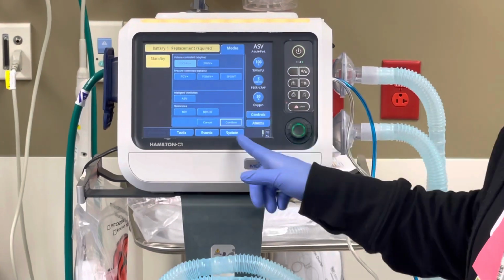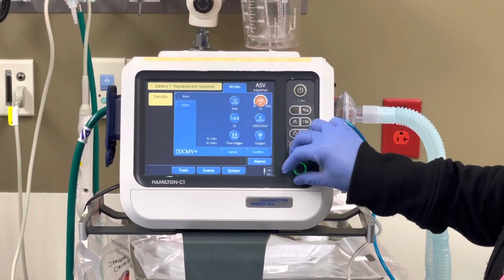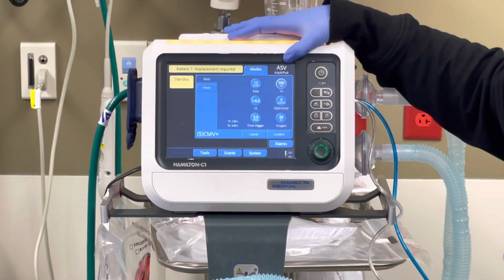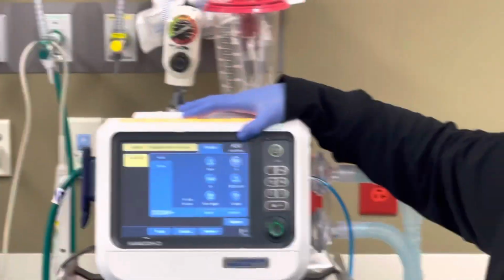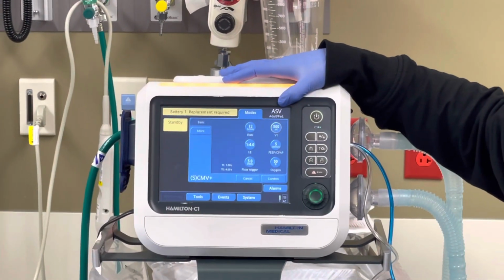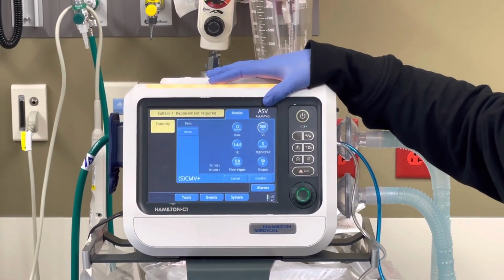So for instance, I'm gonna confirm that one, I'm gonna leave it on a rate of 12, go down to 500. All right, so what I would normally do is I'm gonna do an ideal body weight. I'm gonna determine off of their height what my range for my tidal volume is going to be. So we're gonna say that 500 was correct, so we're gonna go with 500.